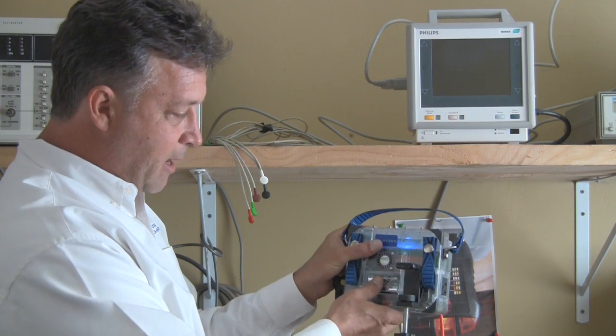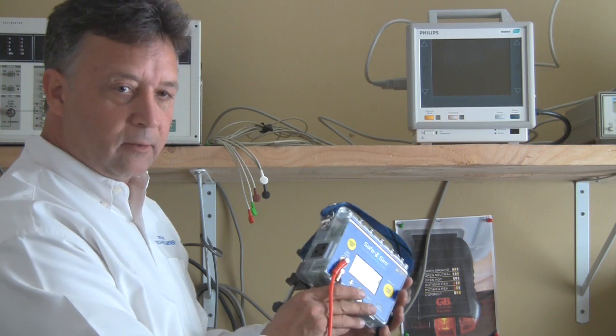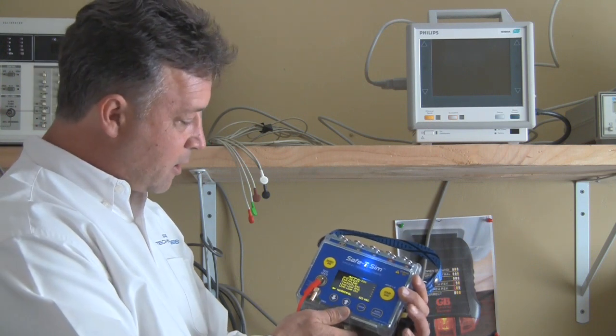It can run on AA batteries, particularly for simulation, but also for ease of testing so when you go from room to room you can stay on the same screen in between electrical safety tests as well.